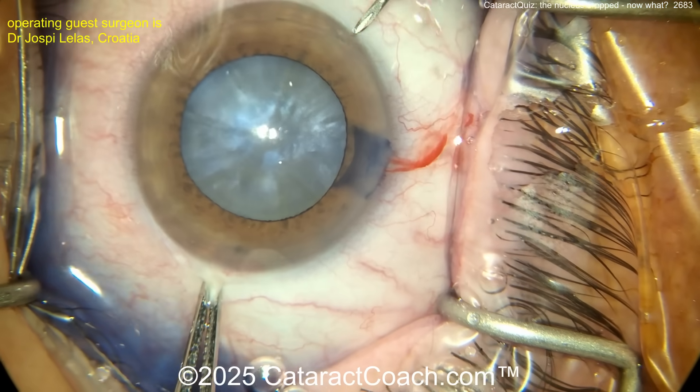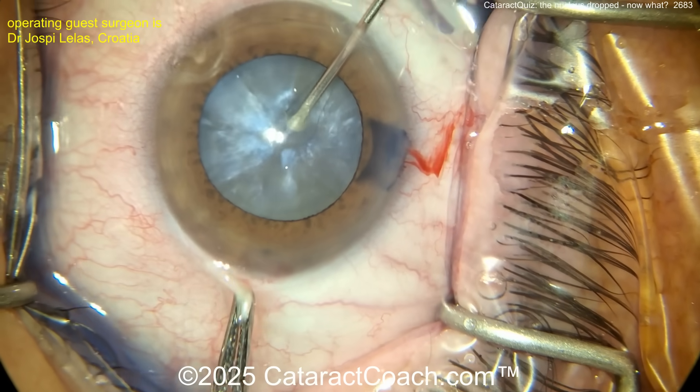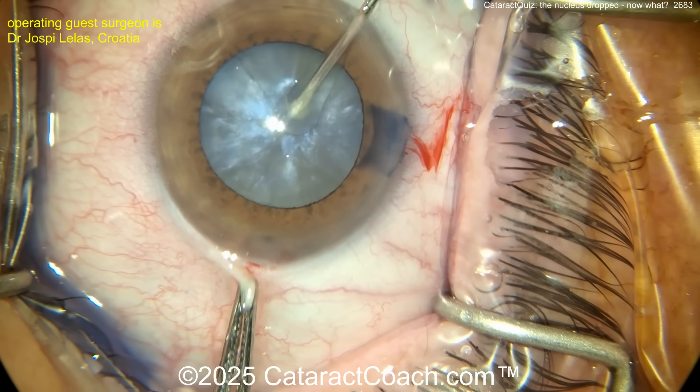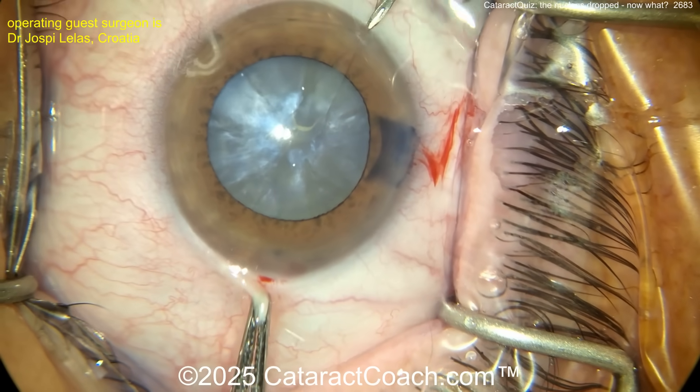The patient was referred to you with this white cataract. It's already been stained with trypan blue dye. Going in with a needle at the limbus, aspirating and doing some puncture of the lens capsule to get that liquefied lens cortex out — so depressurizing the bag. It looks kind of reasonable there.